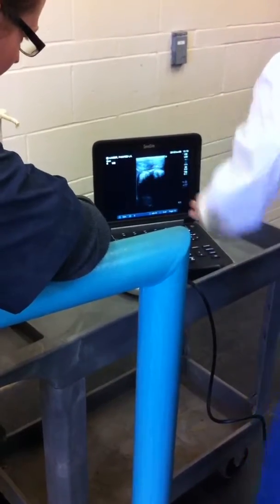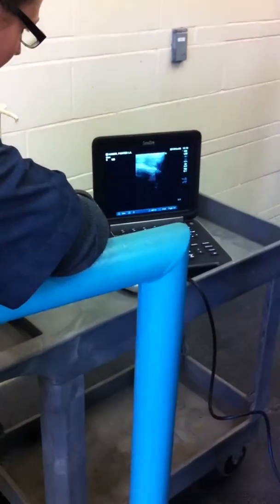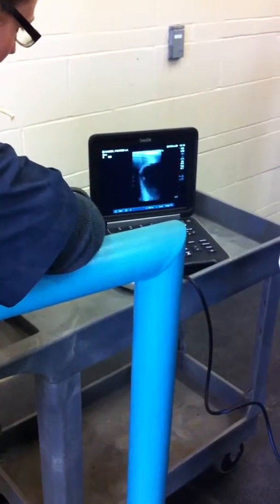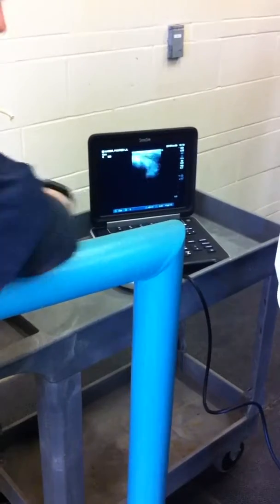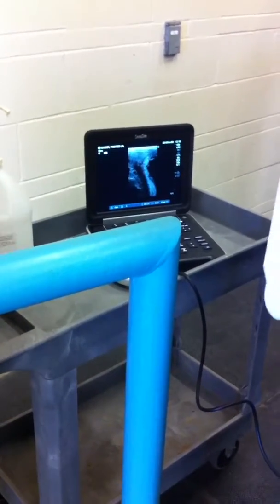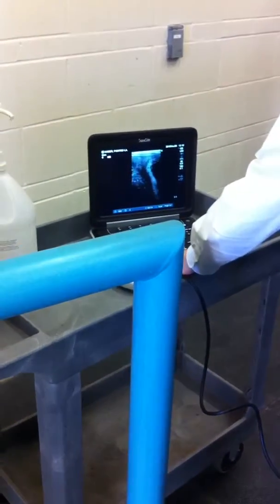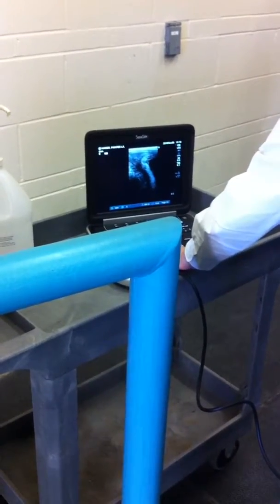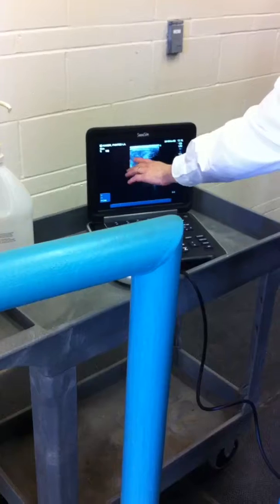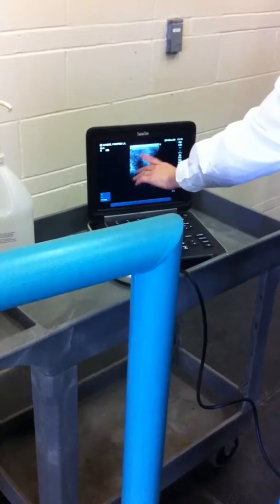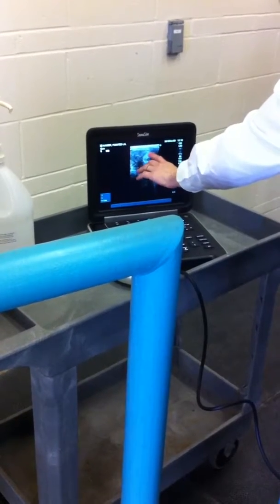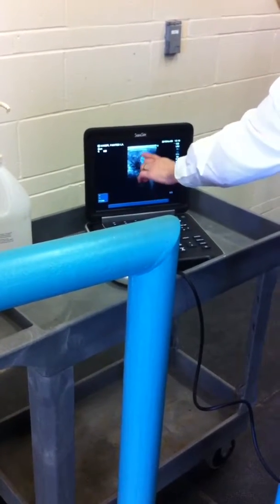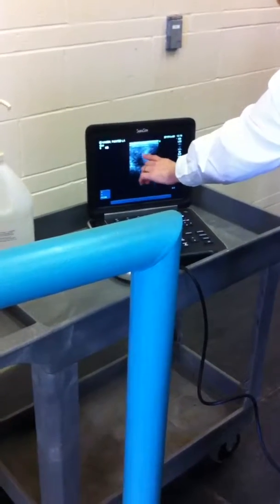Cervix here is closed, and here is the placenta overlying the surface in the uterine wall.